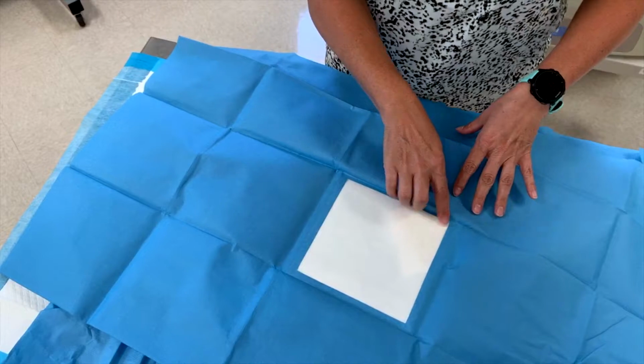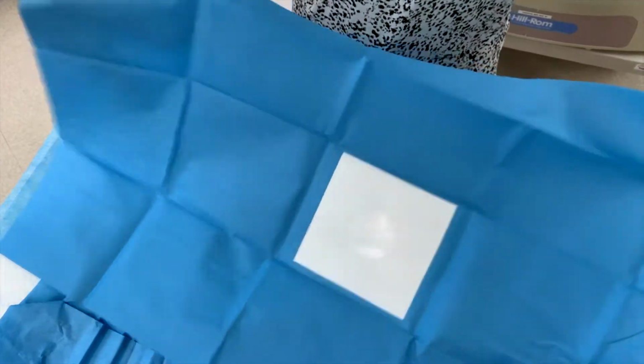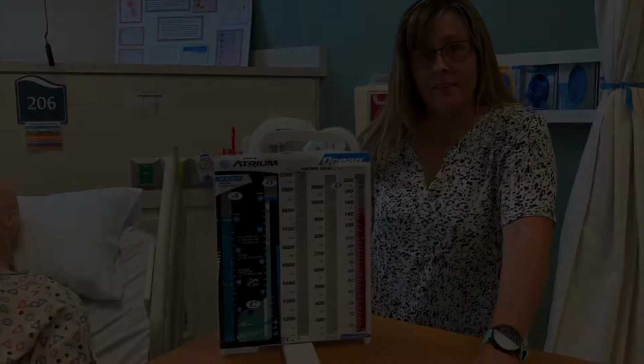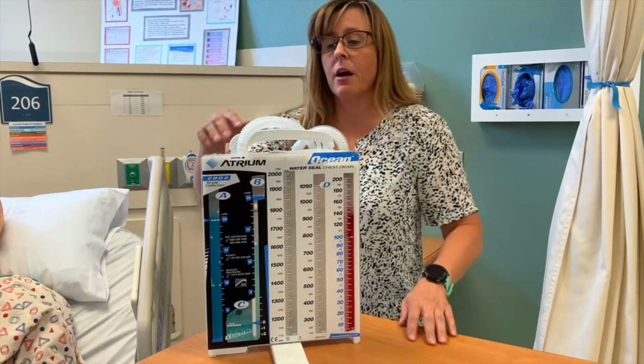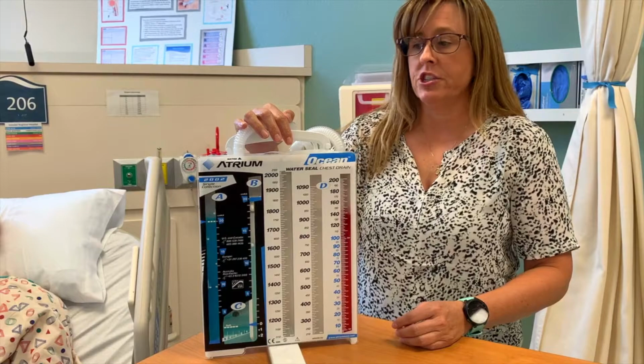All right, so this is what we'll go over the patient and mark our area where we're going to be going. All right, so Mr. Williams, he's here, he's connected. We got his chest tube in. Now we got to get this thing moving and shaking, all right?